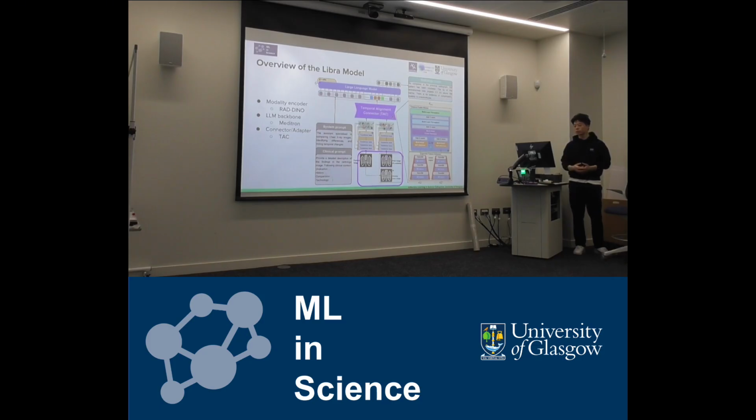To ensure consistency between training and inference, we introduced a simple but very efficient solution: a dummy pair image, which is just a copy of the current image if the previous scan does not exist. This helps mitigate spurious inference about the non-existing scan and maintains a consistent input to the model for both training and inference.